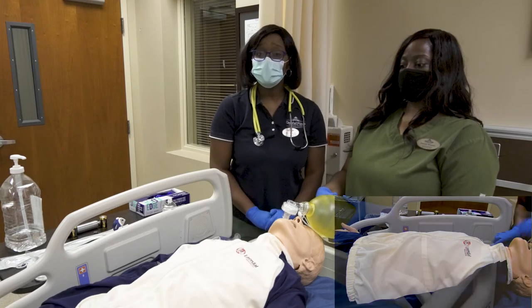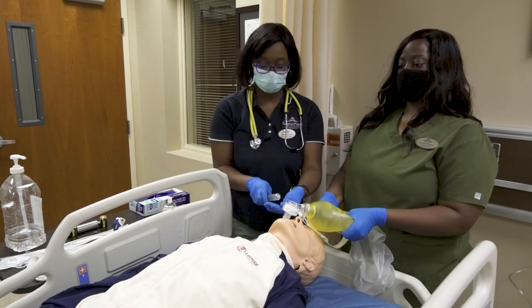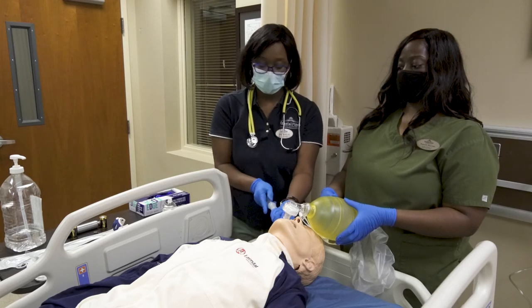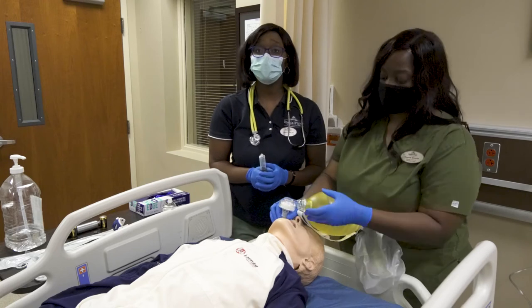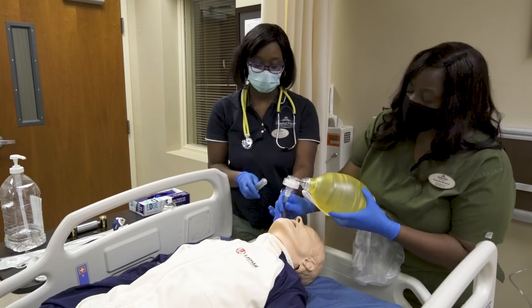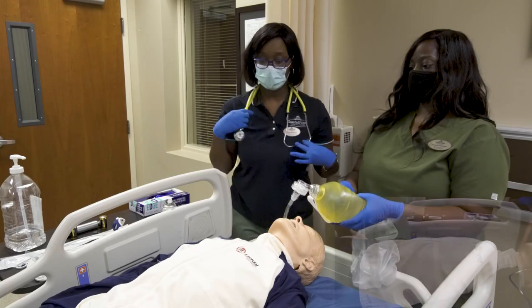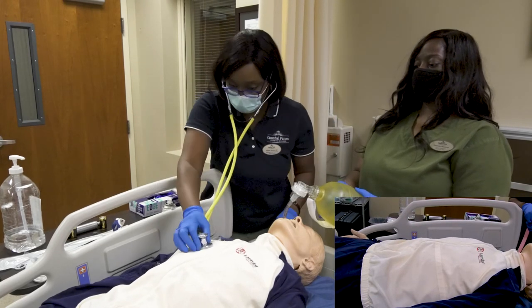If you hear unilateral breath sounds, at this point you will deflate the cuff and draw back your ET tube to achieve bilateral breath sounds and bilateral chest rise.